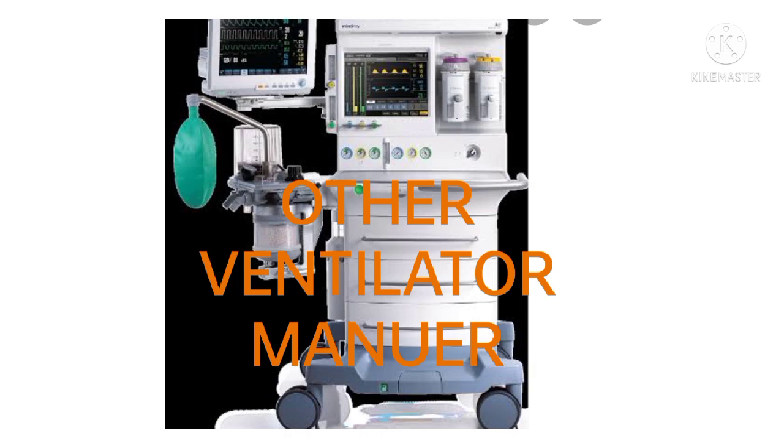BiPAP is used for COPD patients with heart failure and acute respiratory failure and for patients with sleep apnea. BiPAP may also be used after extubation to prevent reintubation. Patients with shock, altered mental status or increased airway secretions are not candidates for BiPAP because of the risk of aspiration and the inability to remove the mask.